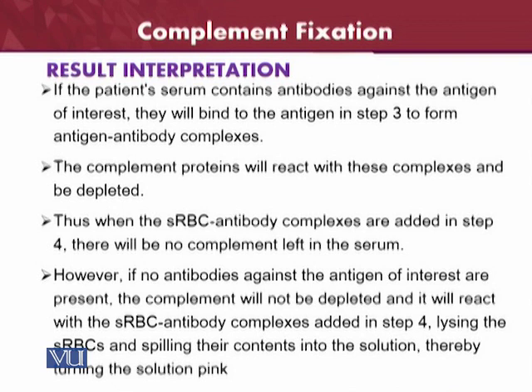If no antibodies against the antigen of interest are present, the complement will not be depleted and it will react on the SRBC antibody complexes, which we are using in step 4, lysing the SRBCs and spilling their contents into the solution, and the solution will turn pink. If the solution turns pink, then it means that it has gone to step 4 and the complement has not been fixed with the antigen, and there is no reaction with the antigen and antibody complexes.